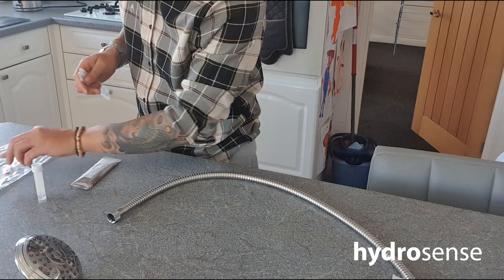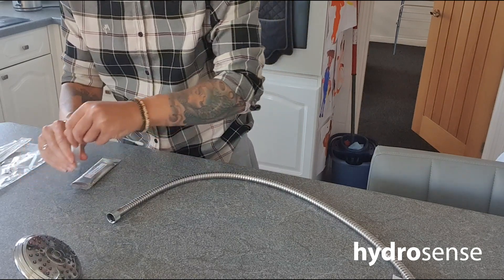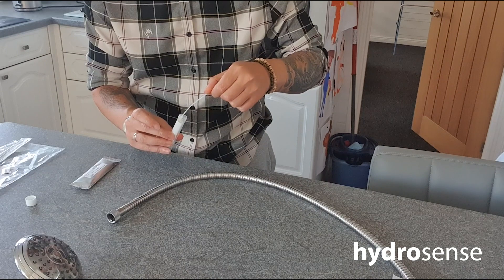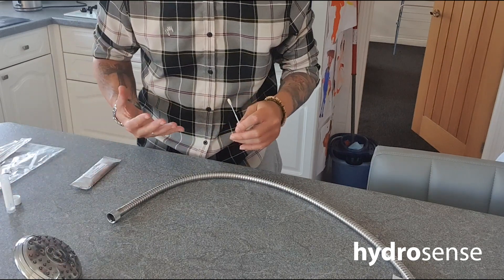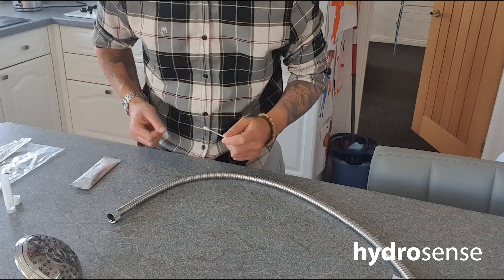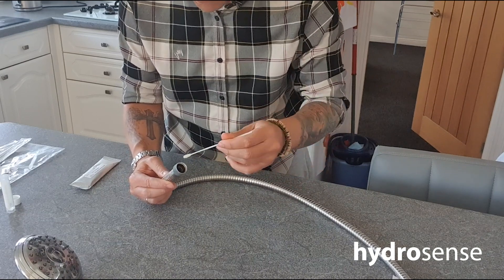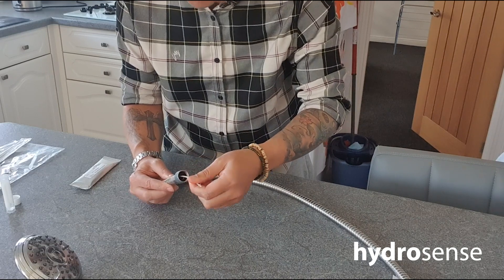We're going to take the swab out of the packet and soak it with the buffer solution — just like that. When we use the swab it's going to capture any Legionella within the biofilm. We're going to disturb the biofilm by giving it a good swab over a surface area of 10 square centimeters. So we take the end of the hose, insert the swab, and swab an area of 10 square centimeters.